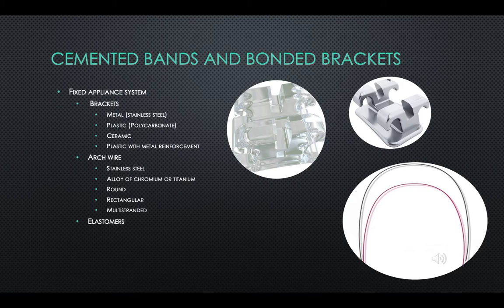Elastomers are available in latex and non-latex materials, and they come in a variety of colors. They are used as chains and on individual teeth to hold wires in the brackets and to apply light continuous force to close spaces between teeth. And this is an example of elastomers.